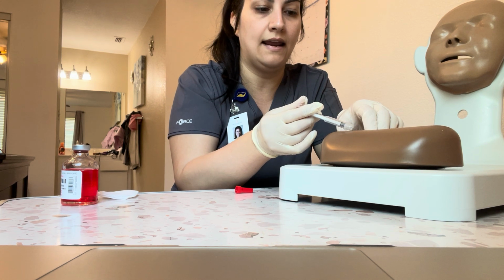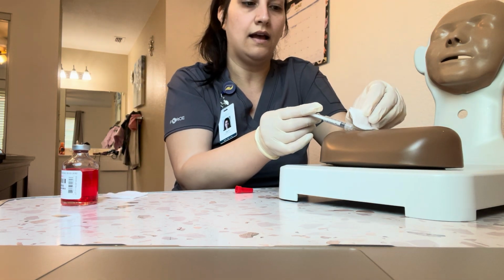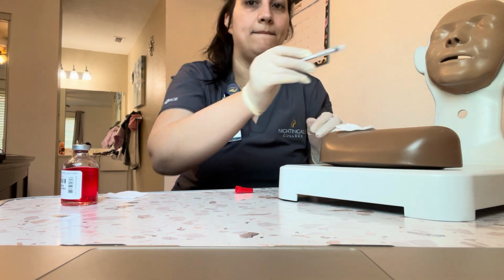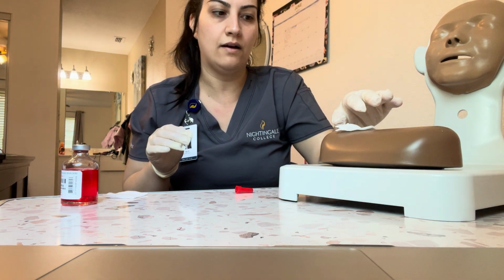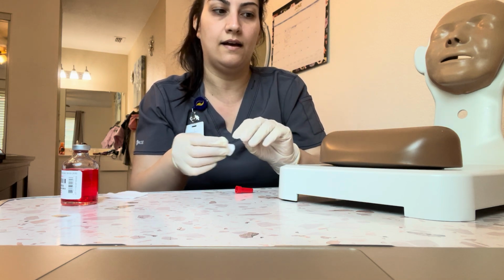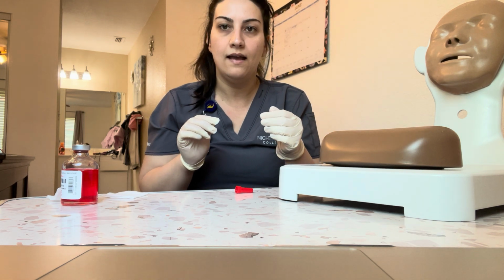I will go ahead and grab my gauze pad here. I will slowly get that out, and I will immediately throw this into the sharps container here. I will not put any pressure here. I will gently make sure that there's no bleeding, and we assess that there's no bleeding on there, so no need for a band-aid.